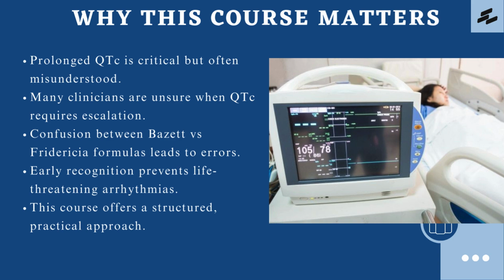This course will equip you with the ability to recognize normal versus prolonged QTc values, considering both age and sex differences, an understanding of correction formula strengths and limitations, recognition of clinical red flags that require urgent action, confidence in managing drug-induced QT prolongation, and a structured framework for applying knowledge in practice. By the end, you will have practical skills to interpret QTc safely and escalate appropriately.